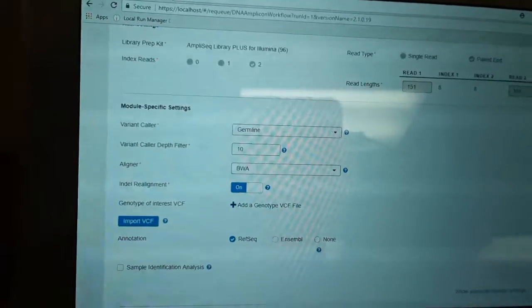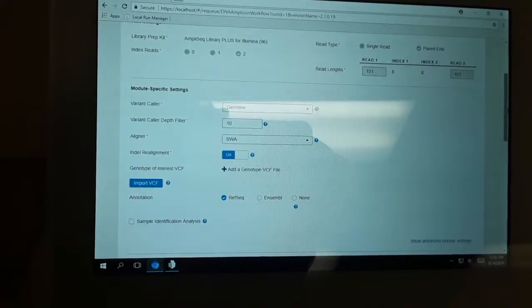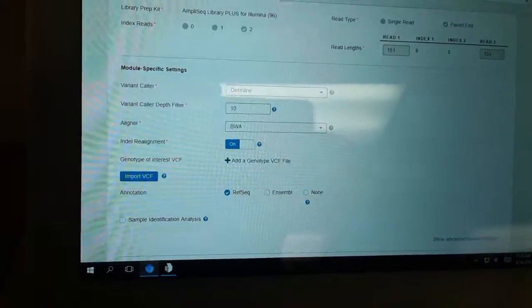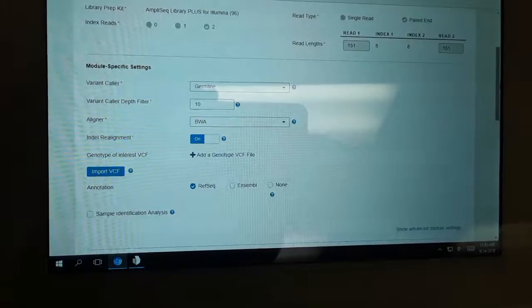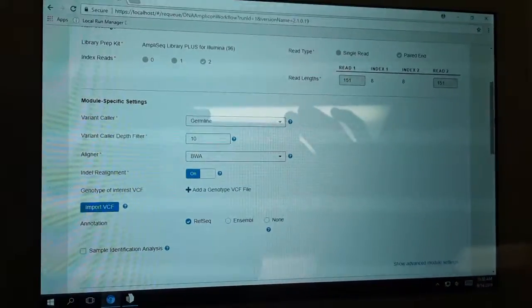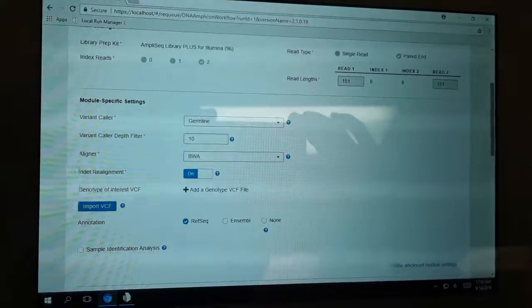the analysis, it'll take about 110 minutes. It will align all the reads for all 16 samples to the human genome and look for variants that are different from the genome reference sequence and generate variant call files and reports that we can use to analyze sample data and do research to look for mutations known and new.